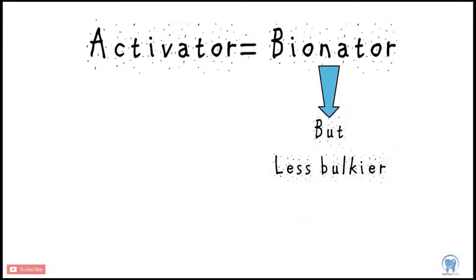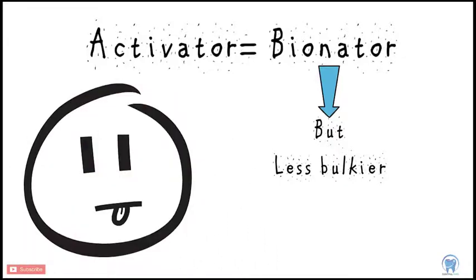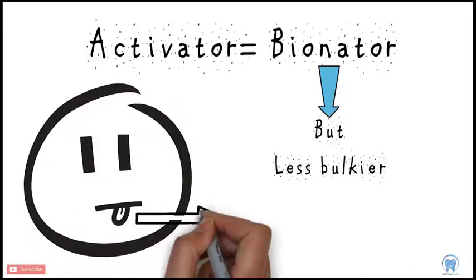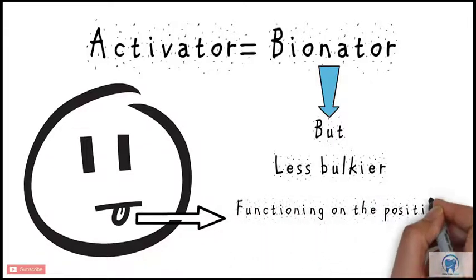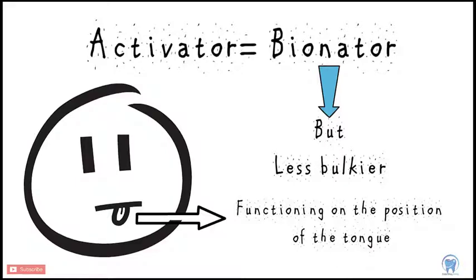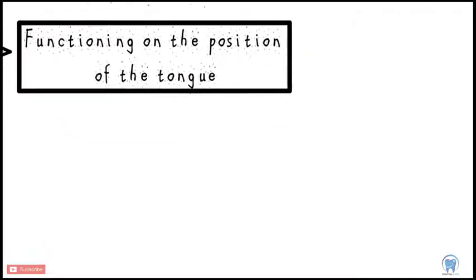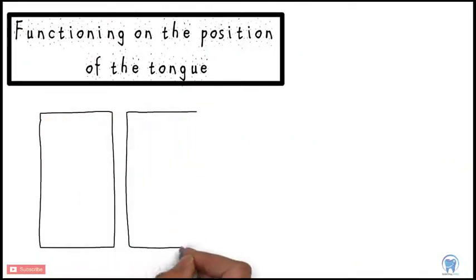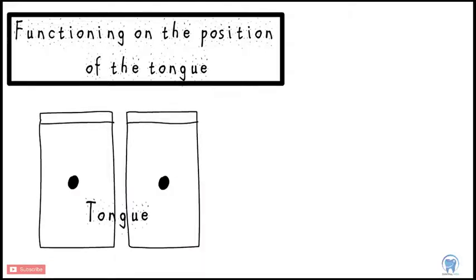The essential concept for the functioning of a Bionator is its action on the tongue, which is the center of reflex activity in the oral cavity. It helps to improve the relationship between the jaws, tongue and teeth. It helps accomplish lip seal and helps to bring incisors into an edge-to-edge relationship to achieve elongation of the mandible.